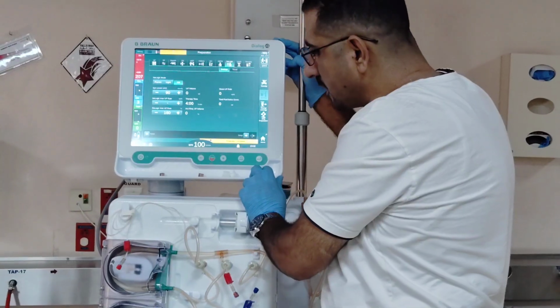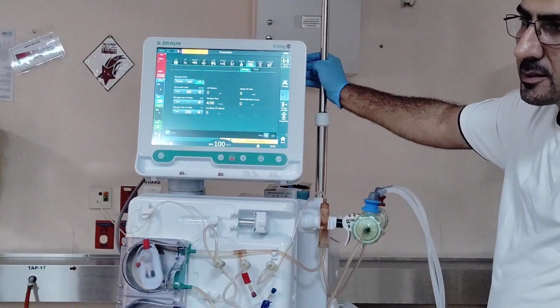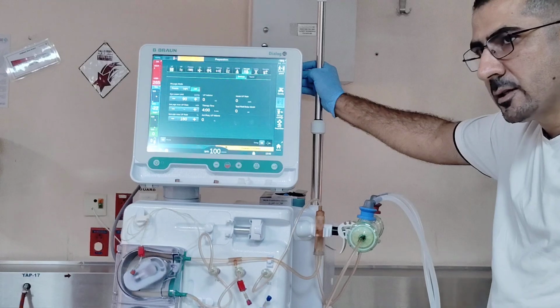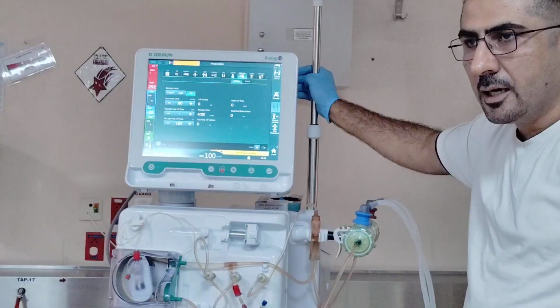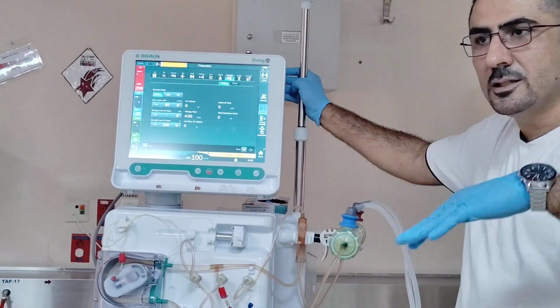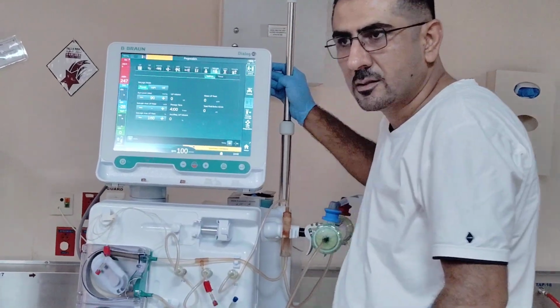The biofeedback, as mentioned before, by this system we can decrease the frequency of hypotension by controlling the relative blood volume or hematocrit. Okay, the blood pressure. So before getting any hypotension, the system starts if we activate it from here. The system starts to tune with the patient according to the blood pressure. The only thing you have to set is the systolic lower limit for this patient.